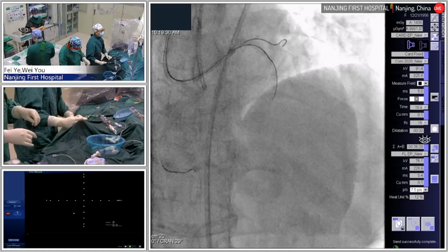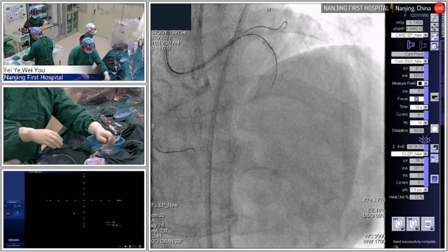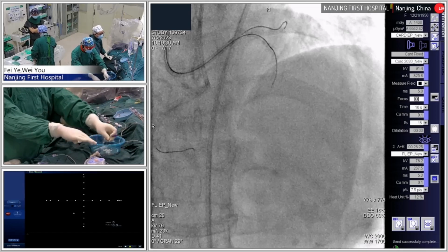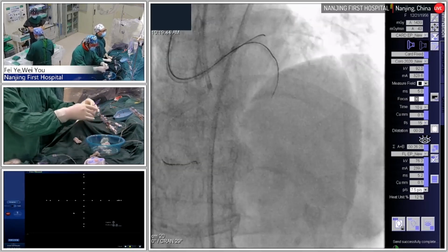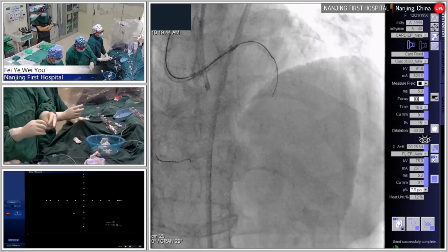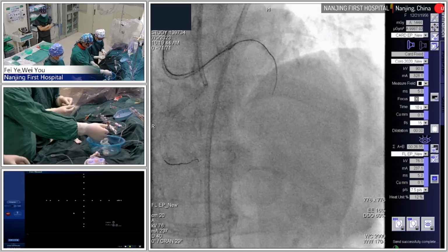Make sure to maintain the wire in the position, stable. Should I use the KDL again? No problem. You can use it. Compared with the microcatheter, KDL can go through the proximal segment and ease my proximal tracking of the wire. Okay, no problem. You can use a KDL.